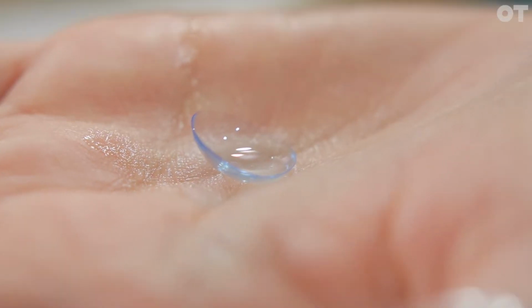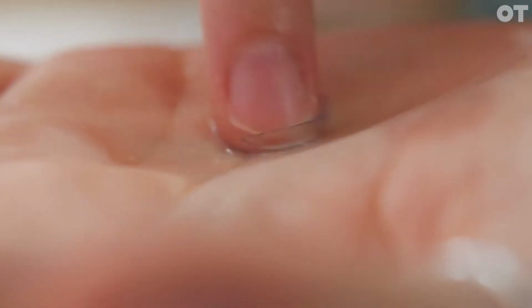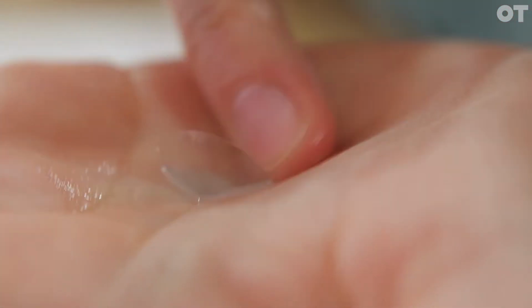So when you're then teaching a patient, you need to convey the hygiene all the way through, so everything you do needs to be very hygienic. You're not going to show somebody on yourself touching your eye and then touch their contact lenses. You demonstrably go and wash your hands again. You don't want your hair falling in the way, so tie your hair back first, wash your hands thoroughly. I usually show them on me, I'll put one in and out on myself just to show them what I'm doing, show them what to expect, then demonstrably wash my hands, make sure they do the same.